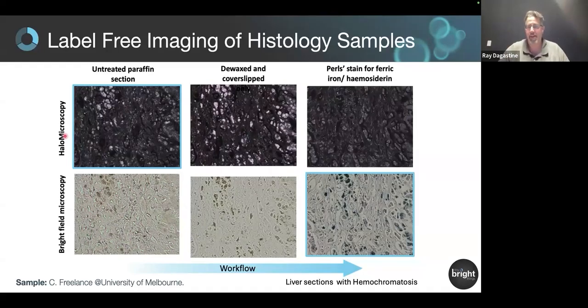And I've had this conversation with Ali. He's never given up staining. He wants more lasers and more wavelengths to look at his tissue sections. But when you get to samples where you don't have a lot of it, you want to get more insight before you have a staining pathway, this becomes an interesting idea.